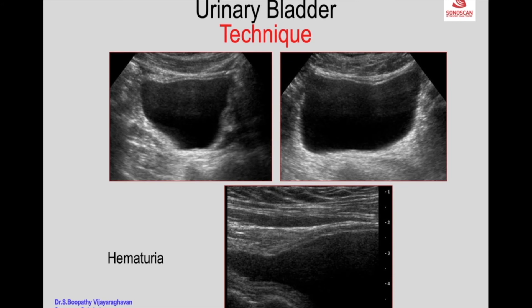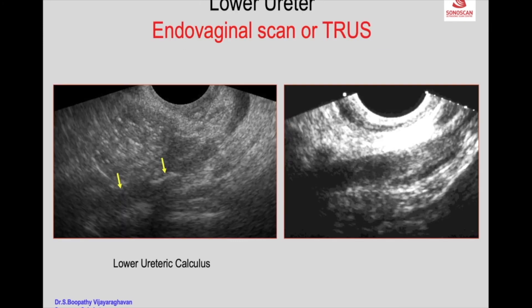This is a patient presenting with hematuria. You see the sagittal scan and transverse scan. Another example shows a slightly dilated distal most ureter where the obstruction is due to a soft tissue mass. In a diabetic patient, it is a sloughed papilla causing obstruction in the lower ureter.